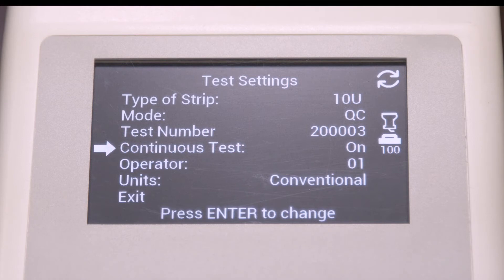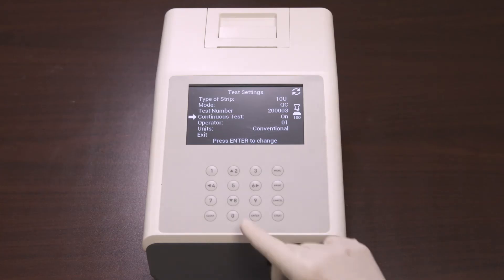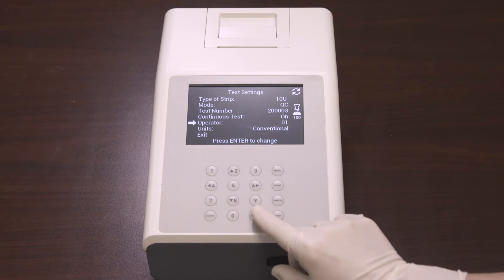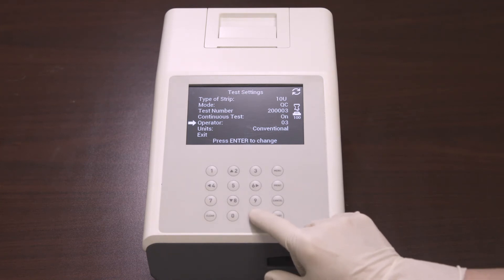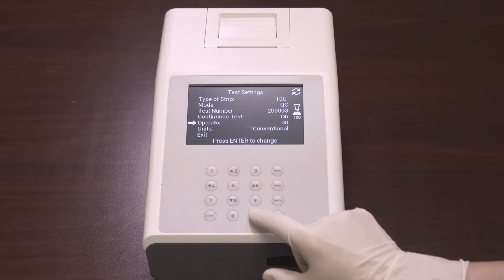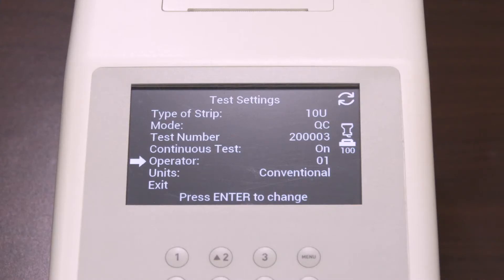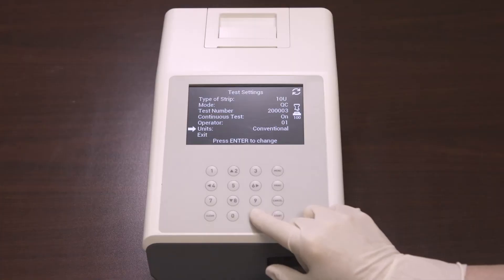Next is operator. Select operator ID and press enter to increase the number by one. After the number reaches 10, it will revert back to 01. The last option in the test settings is the units. Select the units and press enter to cycle the units between conventional or SI units.